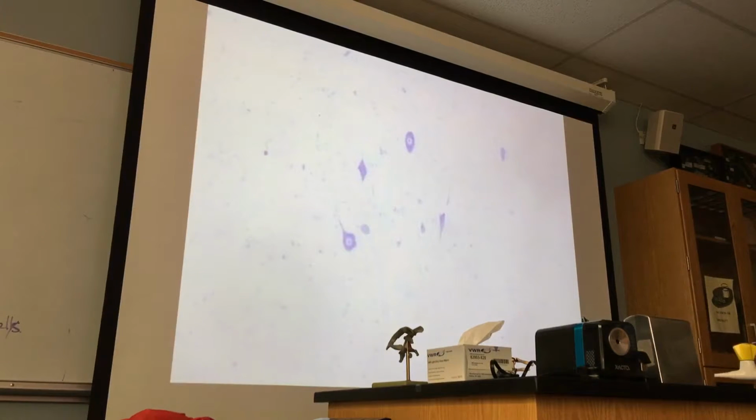With certain chemicals, DNA and RNA interact differently. RNA will give a positive reaction, DNA will give a negative reaction. So, though DNA is not stained, through negative staining you can identify the nucleus. So let us go to even higher magnification, and see very well.